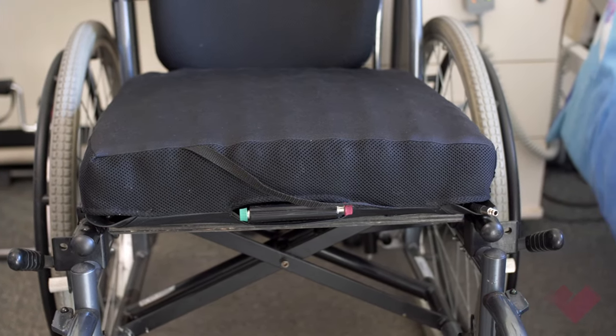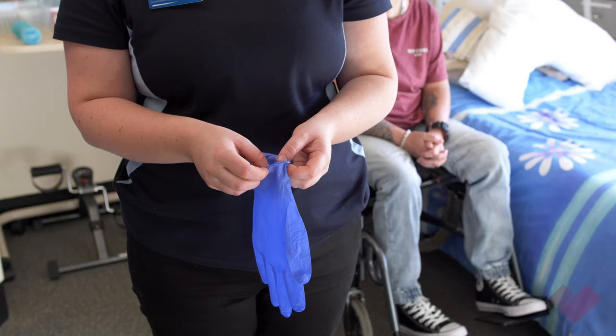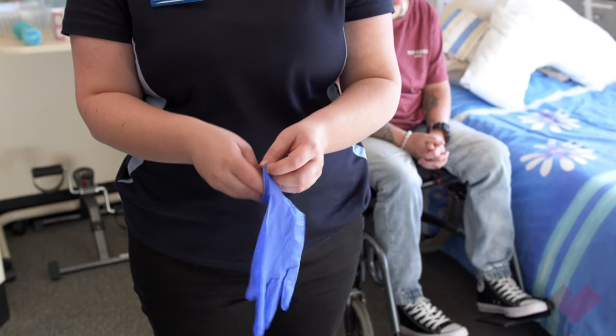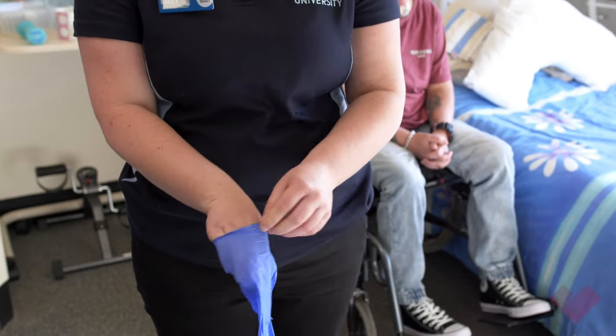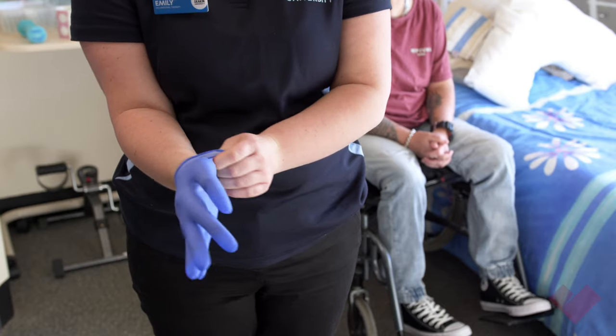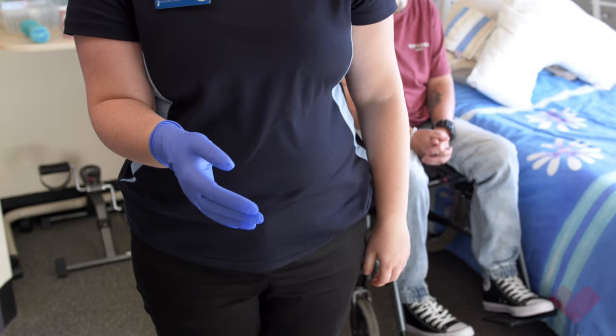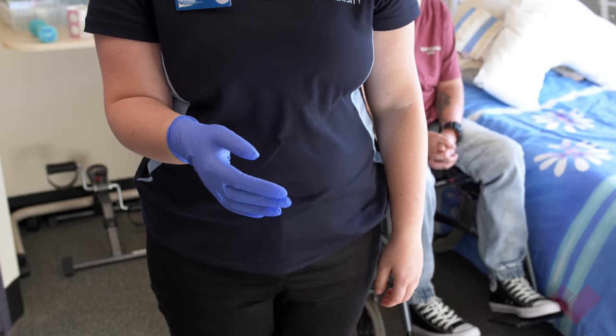The aim is for the person to sit submerged into the cushion, not on top. In order to meet hand hygiene requirements, it is important to glove up when setting up a Roho. Rubber gloves will not slide easily under the cushion and may get stuck, so to avoid this, wear gloves then a plastic bag over the top.